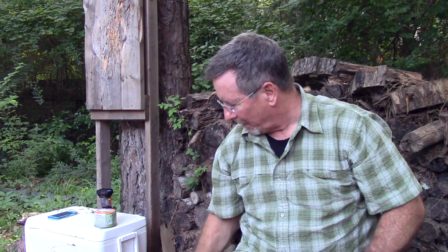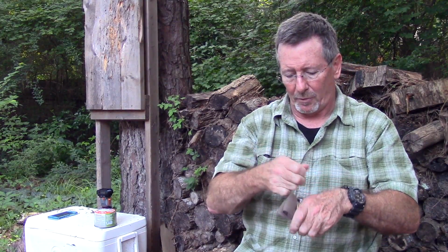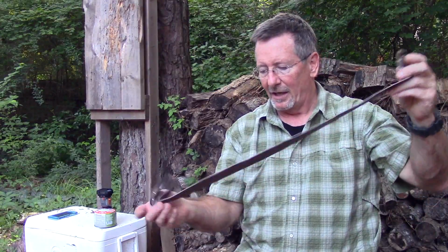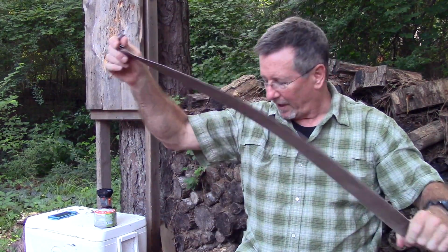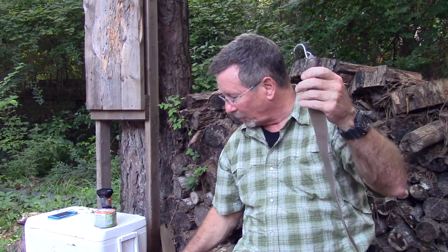This is one of my two everyday carry favorites. The other one, this is actually probably my number one favorite, is a TK4, and I learned about this from James Yeager. He carries these in his ventilated operator kit, and it's a very similar thing. It's a 1.5 inch wide elastic band with a couple of little hooks on it. Very, very simple. And this one is the lowest priced one.